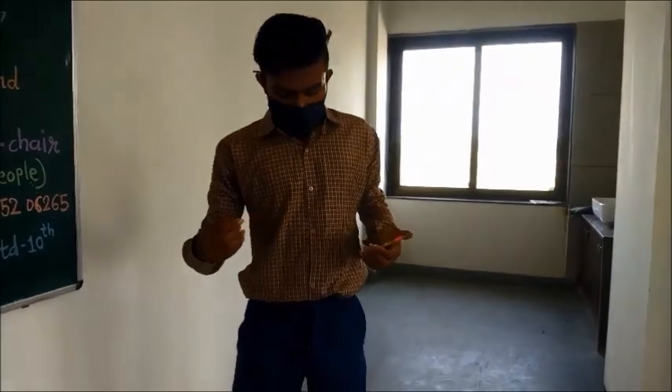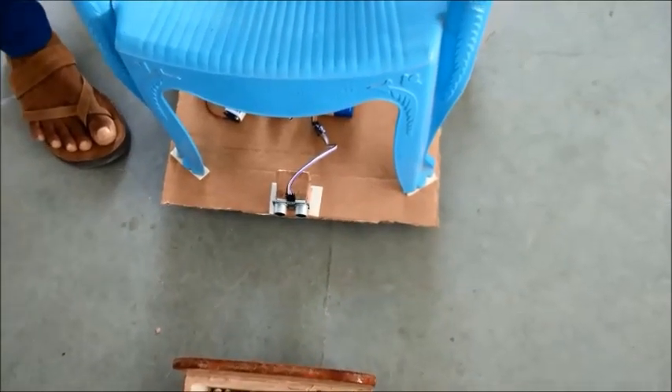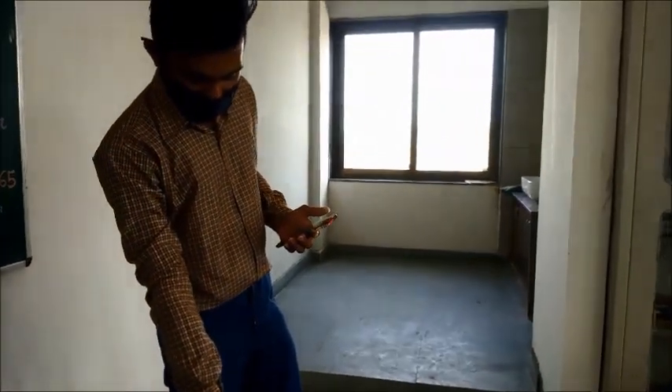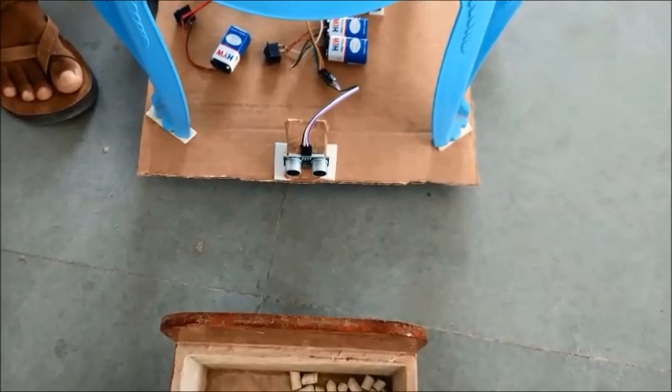Now we will see the testing of the automatic braking system. When any object comes in the direction of the wheelchair, it stops automatically. So whenever the wheelchair is in the running condition and an object comes in its path — Forward — when I speak 'forward' and the object is in the line, we can see it is blocked automatically. Forward. We can see that the object is detected by the ultrasonic sensor and the wheelchair stops automatically.